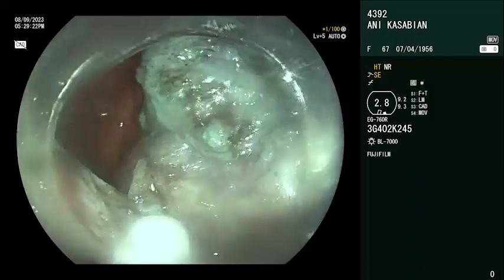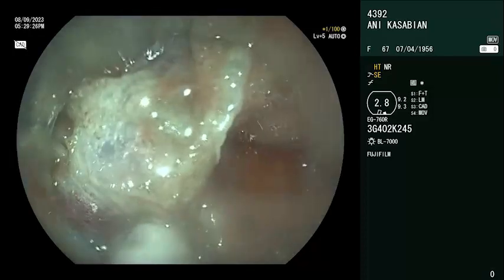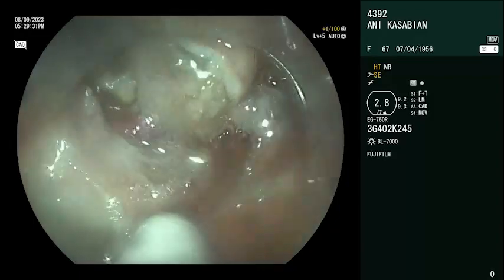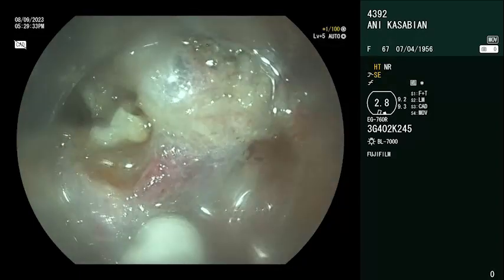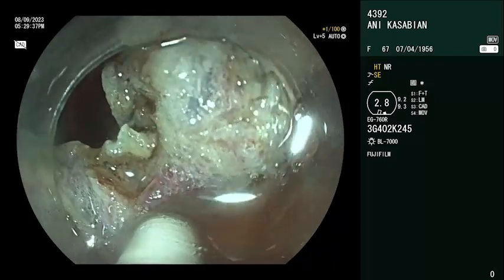It's really important to do the trimming, I mean to liberate the edge of the lesion and to cut the mucosa. Wow. Okay, another one. Good vessels. Allez, soft.